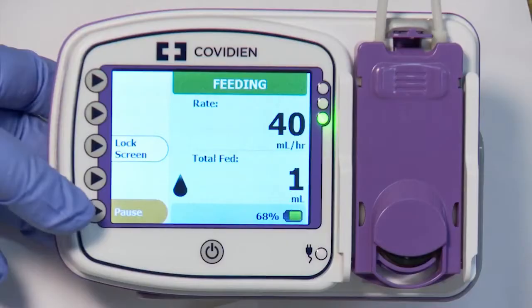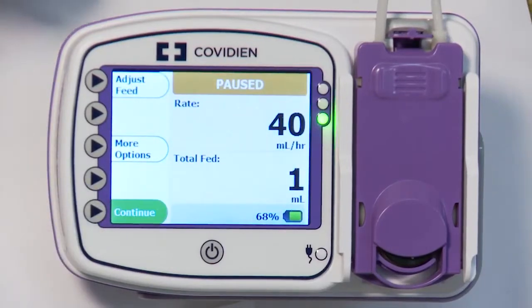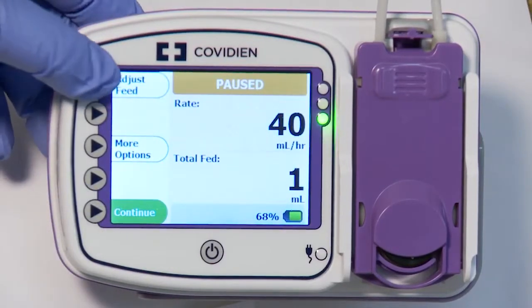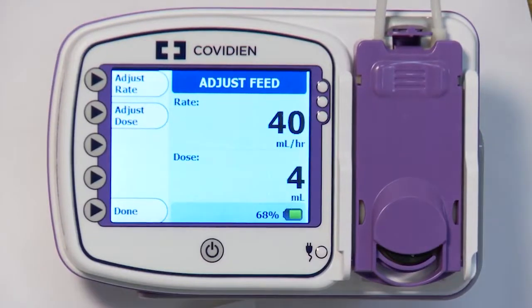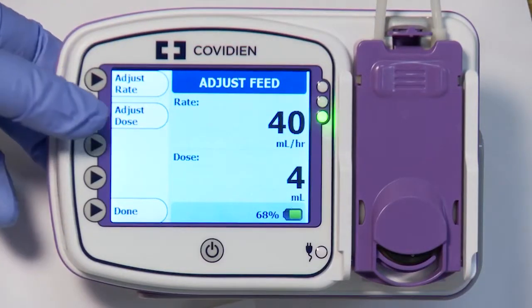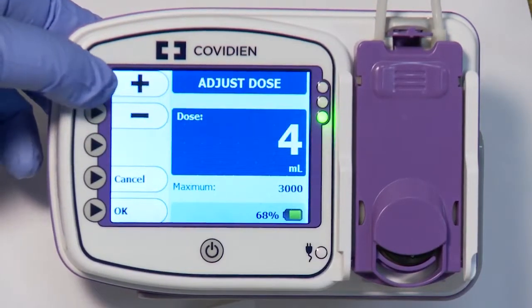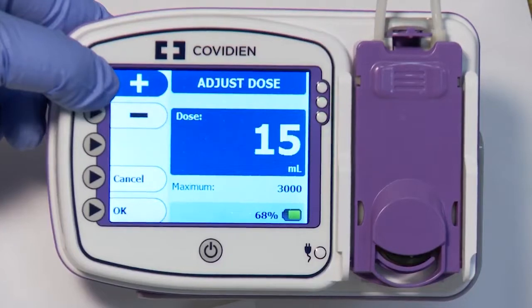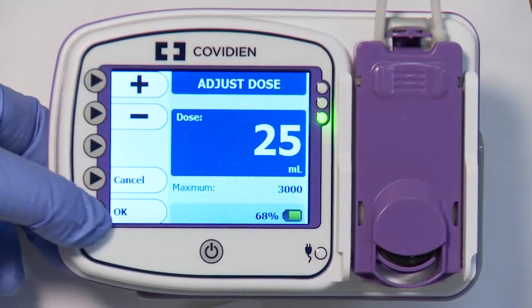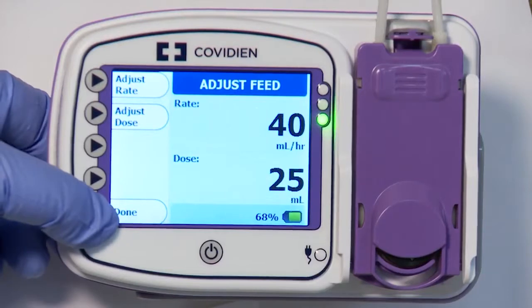From the feeding screen, pause operation if the pump is feeding. Select the Adjust Feed button. If the Dose feature has been enabled, the Adjust Dose button will appear below the Adjust Rate button. Press the Adjust Dose button to set the maximum amount of feeding solution to be delivered. Select OK, then Done to return to the feeding screen.